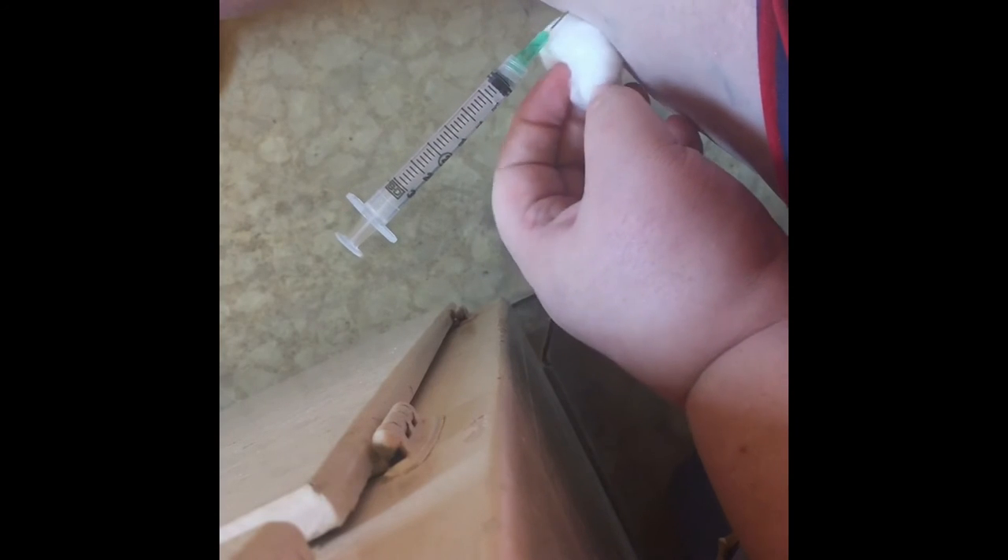Take the cap off the needle — one, two, three. Now this is the part that squicks people out: you actually leave the needle in there, then pull it out. That's the actual injection — now it's done. This rubbing breaks up the ball of injectate in the thigh and will help it absorb into the muscle fibers.